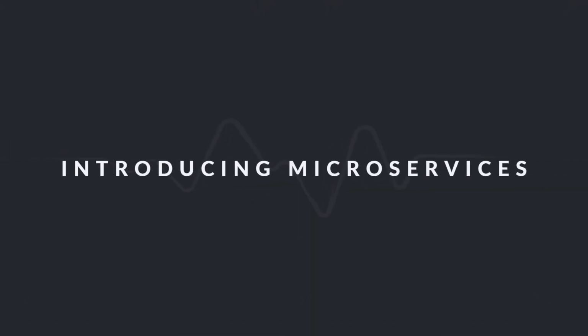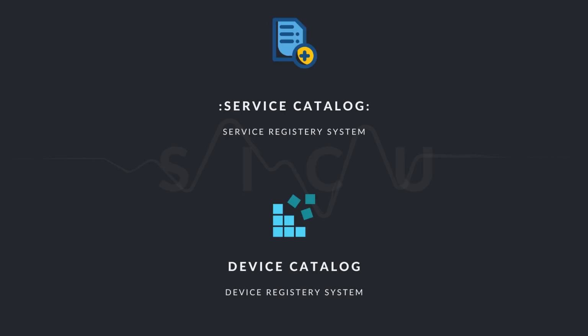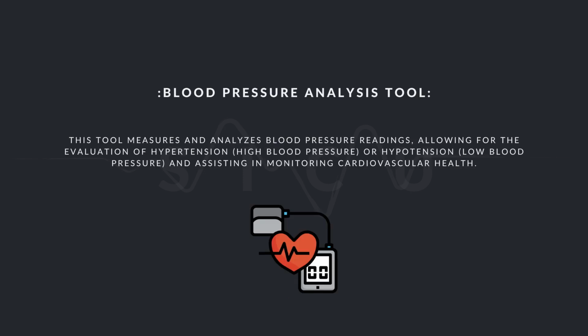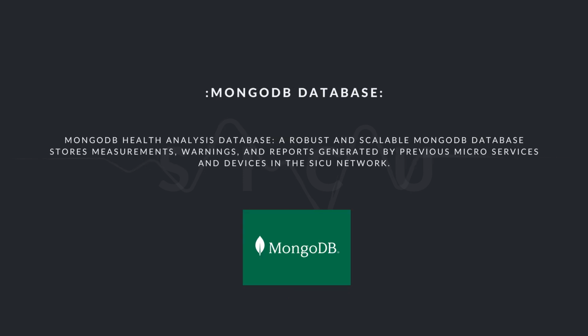There are several microservices working together in the SICU IoT platform, including the device catalog and service catalog, which aim to register the devices and also the microservices into the system. In addition, there are other microservices, including some analysis tools like the EKG analysis tool, oxygen saturation, and blood pressure analysis tools. In order to store information and data in our system, we are using a MongoDB database microservice to store different reports, warnings, and measurements.